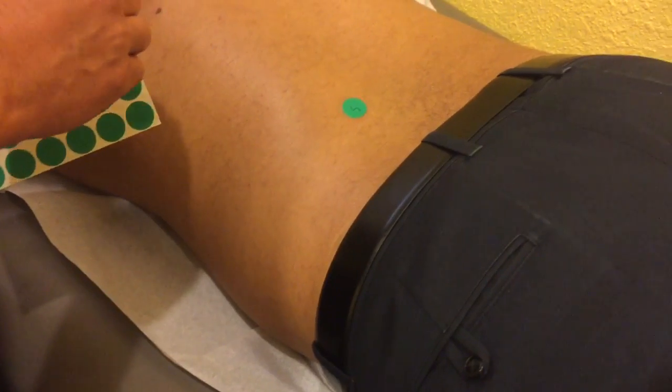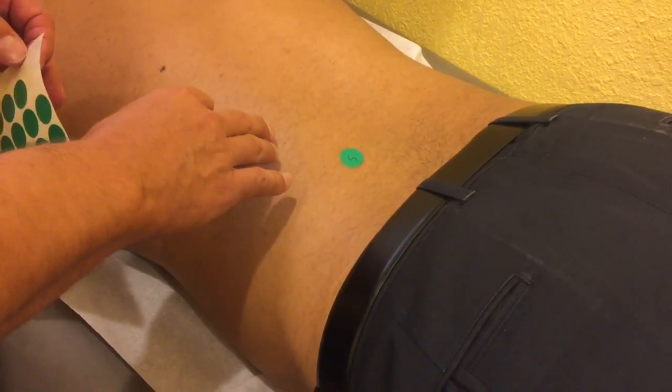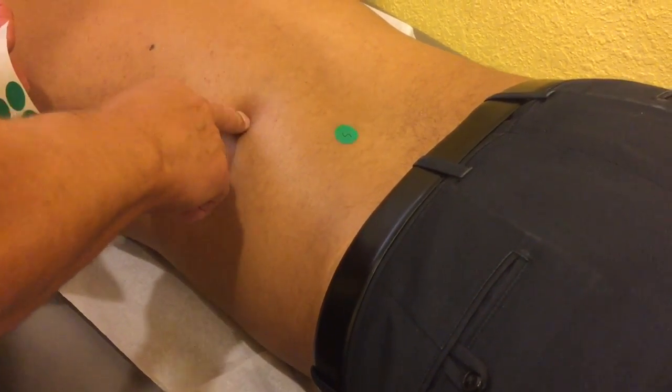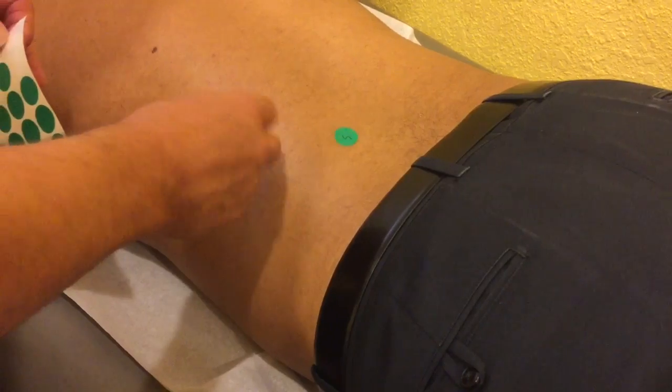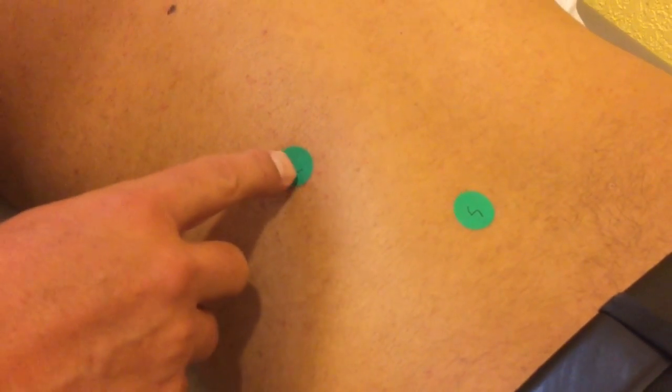Now we're going to find the control site. So we want to find a site that has no tenderness. That's typically going to be rating a 0 or 1. Is this tender at all? No, that's good. Okay, so this will be our control site. So these are going to be sites that we're going to use for testing. This is going to be a symptomatic site and a control site.